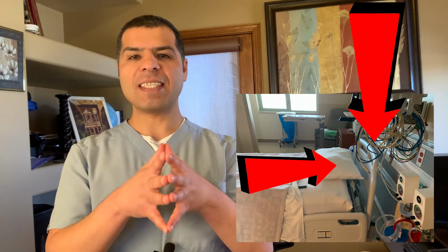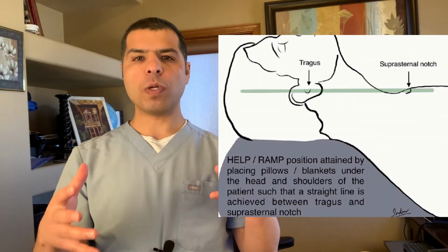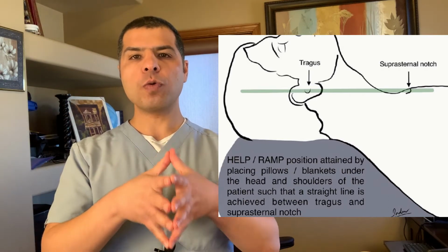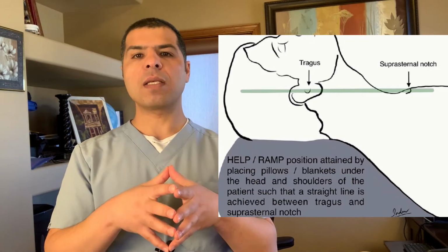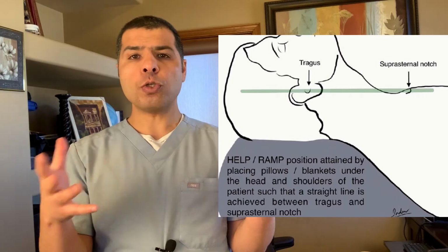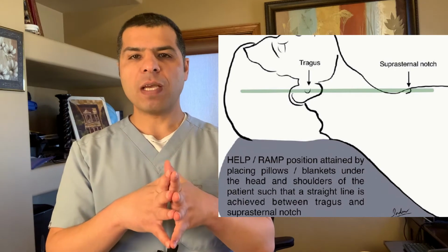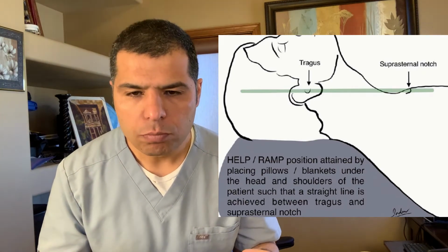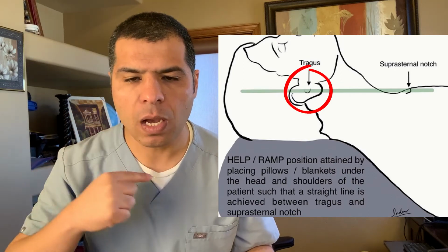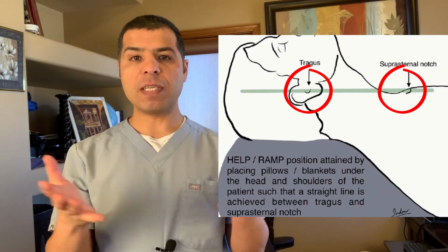And here I'm going to take a second to talk about what we call sniffing position. There have been some confusions about what the correct sniffing position is. In my description field, there is a video talking specifically about the correct sniffing position. I recommend you watch it. Just to show you quickly, the correct sniffing position: if you're sniffing like a flower, you lean forward. So you see the ear hole, the ear here should be in the same line as the sternal notch. So that's the correct sniffing position.